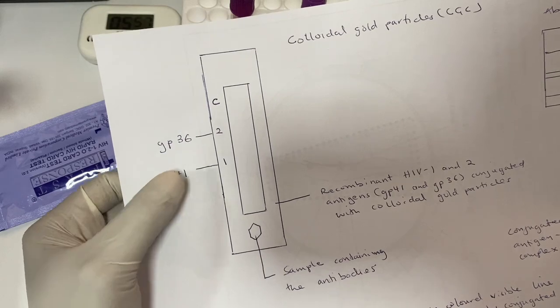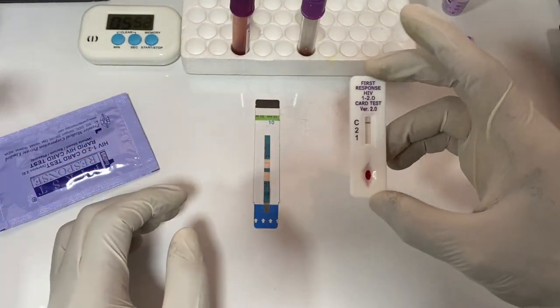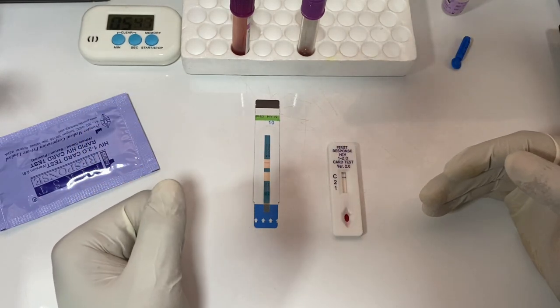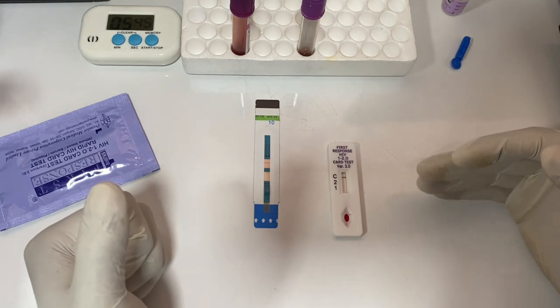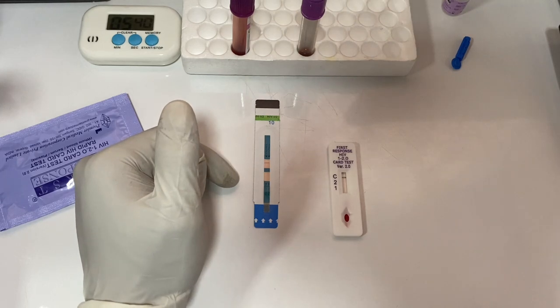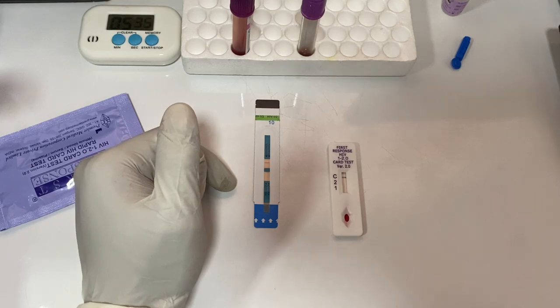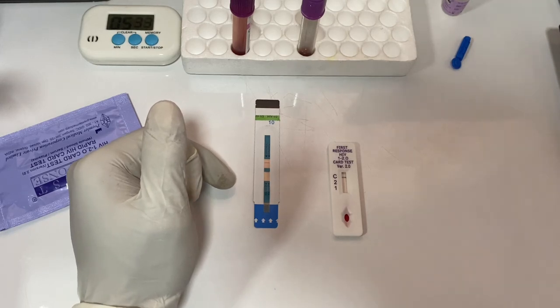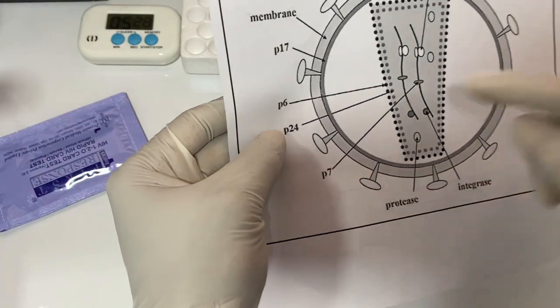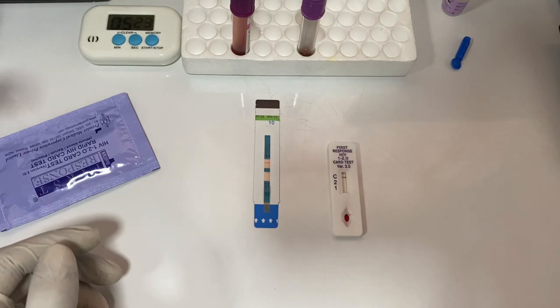This test kit contains both GP41 and GP36, so it is able to differentiate between HIV-1 and HIV-2. The other kit uses the capsid protein P24, as shown in the diagram. It was specifically developed to detect that particular antigen.